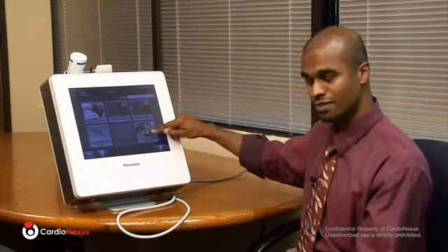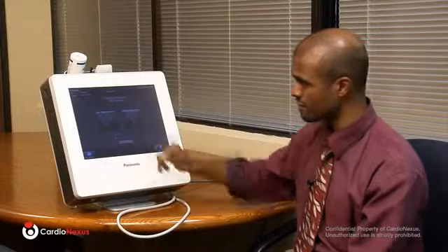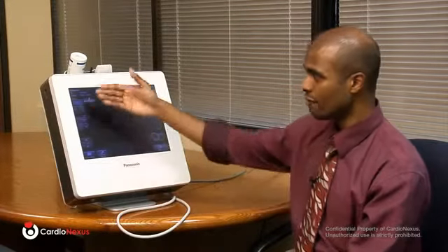Now the last bit of information required to complete the CardioHealth test is the actual ultrasound procedure, so capturing 4 separate ultrasound images from that patient's neck and carotid artery. So I'll simply choose the ultrasound imaging application. The patient's laying down, you'll simply choose which side you want to start scanning on, so I'll choose right. And then you have 4 options enabled.